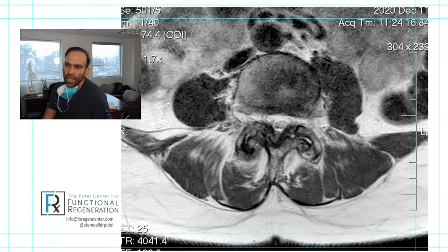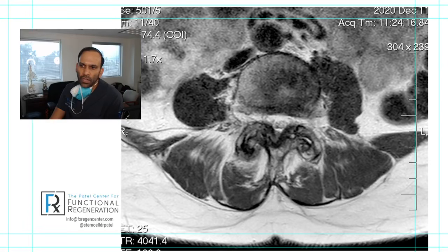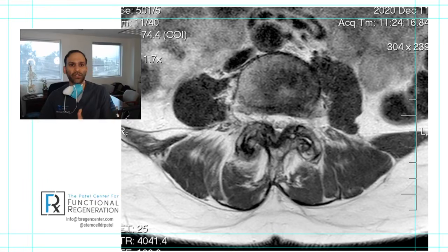And now what type of MRI is this? I have a 3T MRI that is still not as clear as what you show here. Is it the cycle times, are they running low? So with a 3T MRI, whenever you see 3T or 1.5T or 0.3T, T stands for Tesla. That's the power, the resolution of the MRI. 3T is the current highest standard that we have commercially available in the U.S.